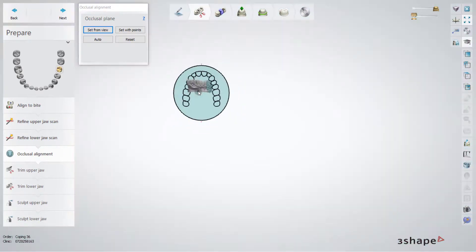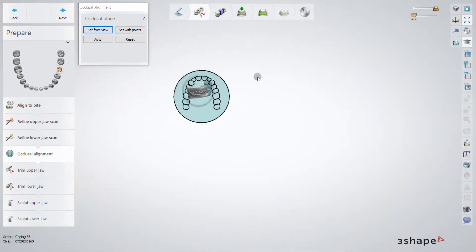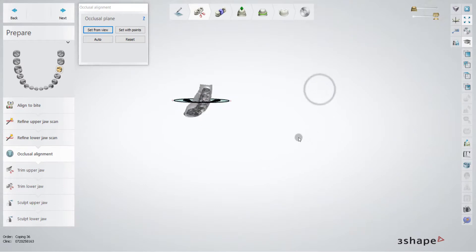In this part, we have to specify the occlusal plane for the teeth that we have.